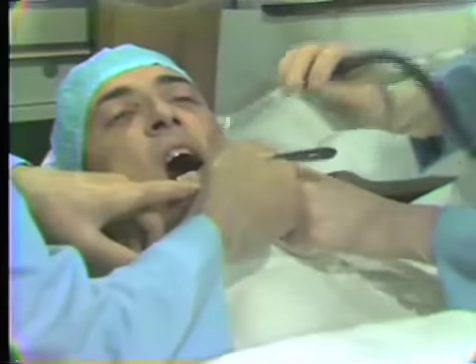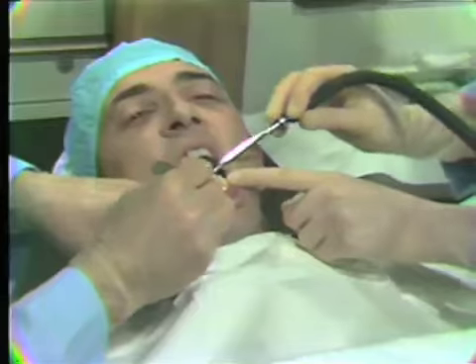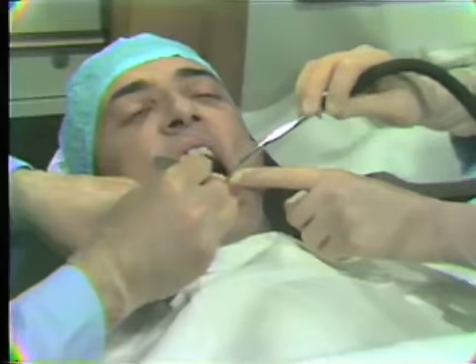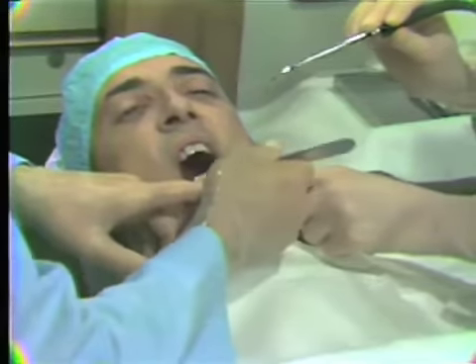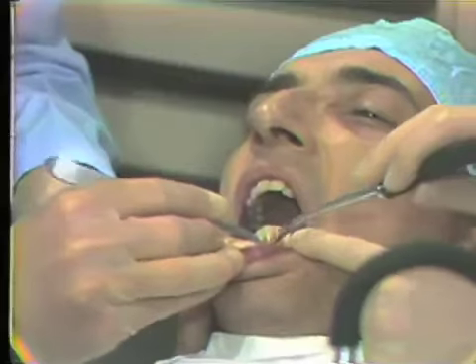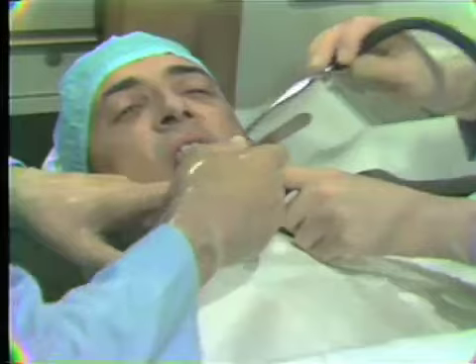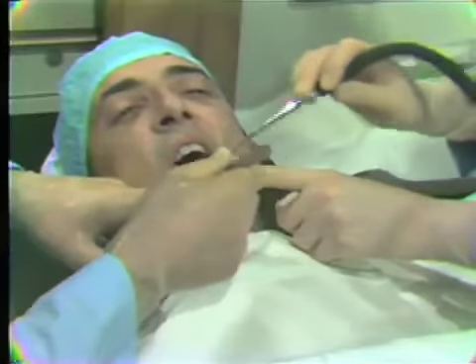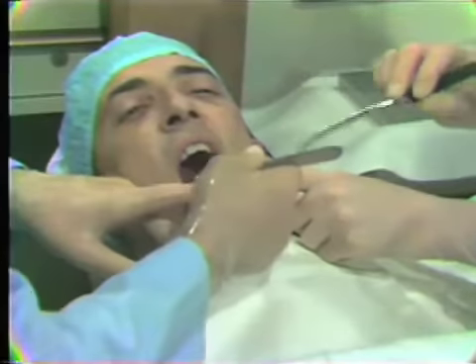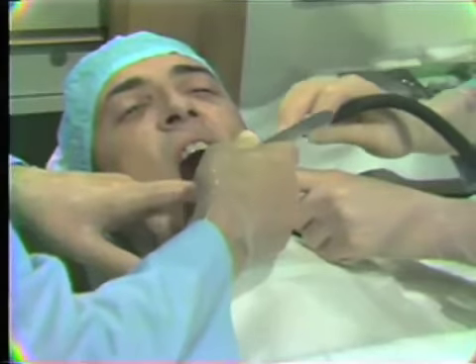Initially, during the surgical procedure, you may notice that there is somewhat profuse bleeding, depending upon the nature of the case and the nature of the procedure. But as the procedure continues, usually the hemorrhage problem is lessened and poses no problem with good aspiration. We continue making our incision around the neck of the 4 mandibular anterior teeth that we'll be dealing with today. We're making what's called an intrasulcular incision so that we can reflect the gingival tissues back and have access, therefore, to the underlying periodontal defects.